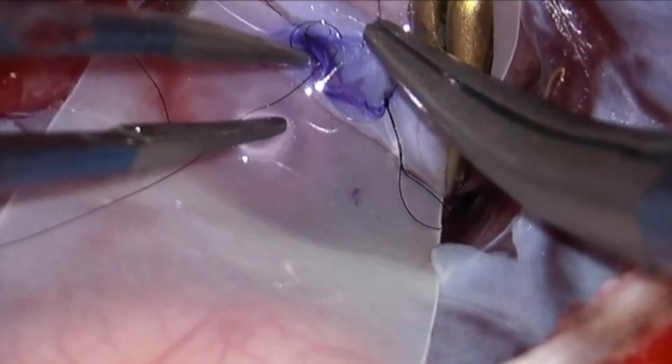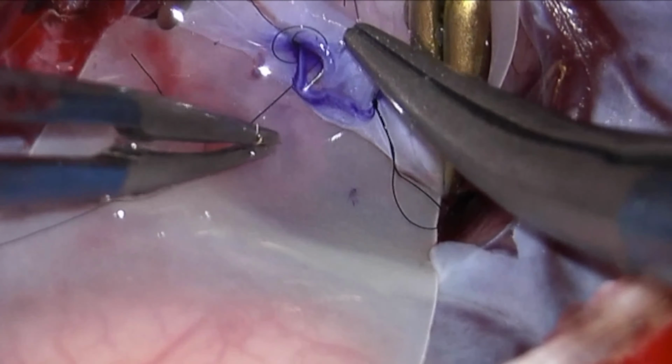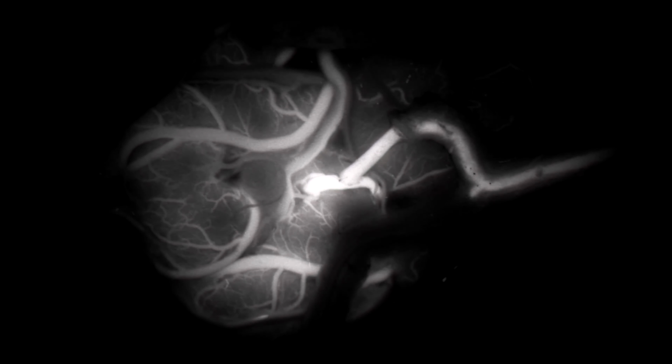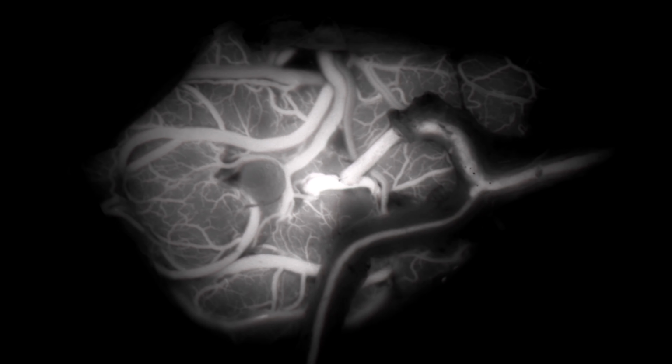That process takes actually a very short amount of time to do the sewing, but then afterwards we do some more testing to make sure that the flow is good, that the flow is distributing in the way that we want it to, and then we very carefully have to close everything back up. Here we're using a fluorescent dye to test that the bypass is open and flowing to supply blood to parts of the brain that were lacking in blood before.